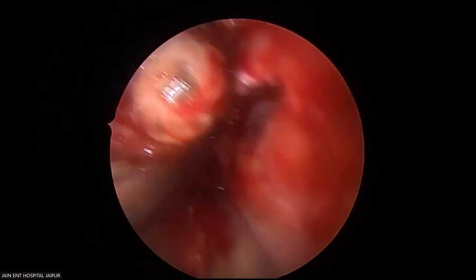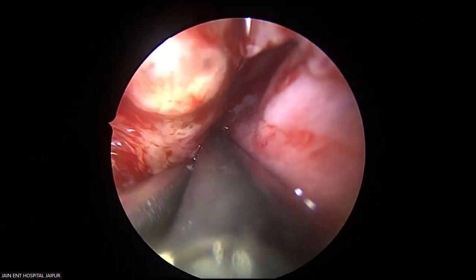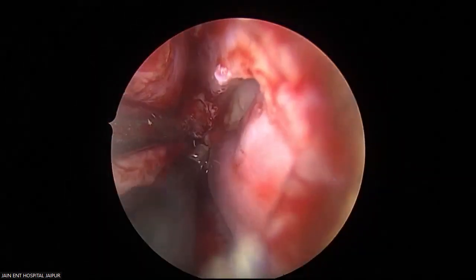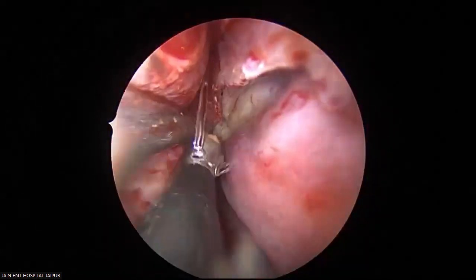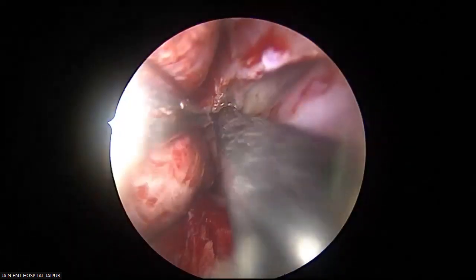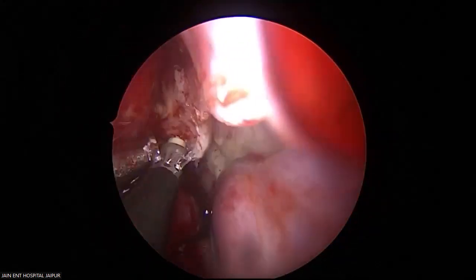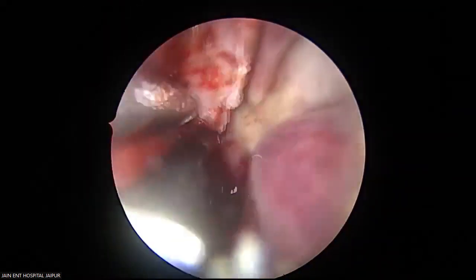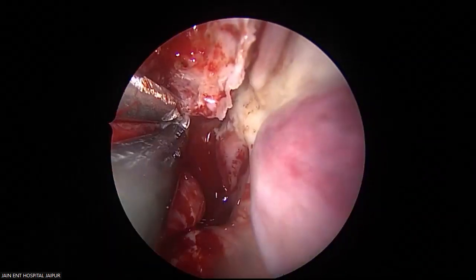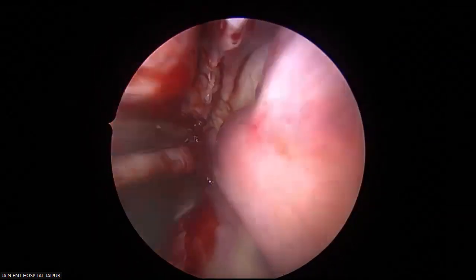So now I will cut off my blood supply coming from the opposite side completely. See this? This mucosal coagulation, completely in a linear fashion, will rule out any blood supply coming from the opposite side. This has no attachment on the adenoid surface, never. Only this nasopharyngeal roof periosteum is the source.